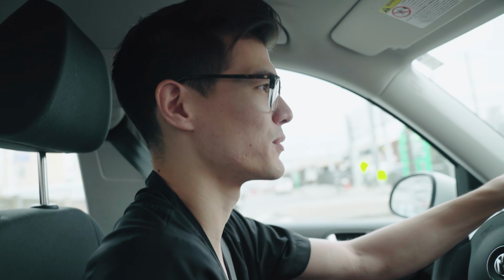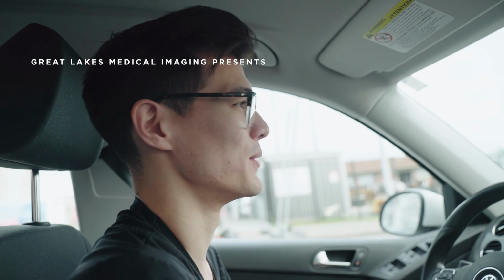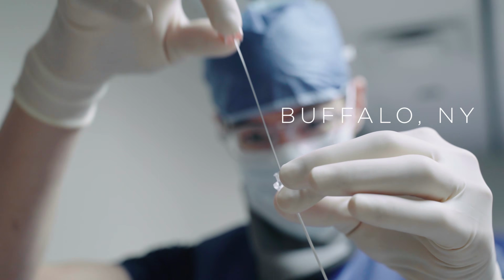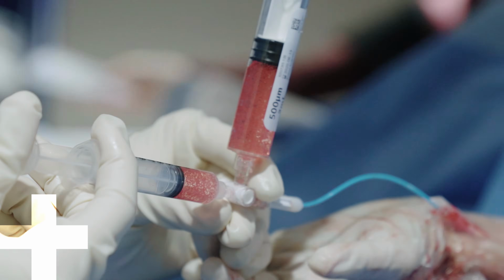Today, Dr. John is covering one of our hospital sites and he is doing a TIPS. We've actually gotten permission to film, so we're gonna bring you, for the first time, into the hospital. Interventional radiology is doing minimally invasive surgeries using image guidance. We do several procedures through small incisions. We keep patients out of the hospital and get them home as quickly as possible.